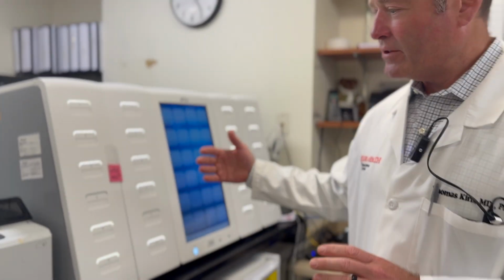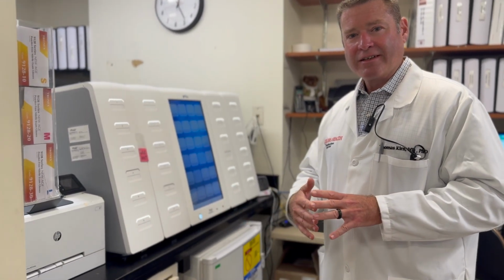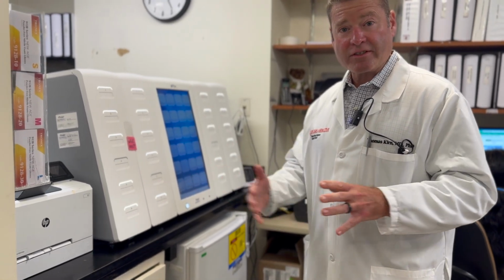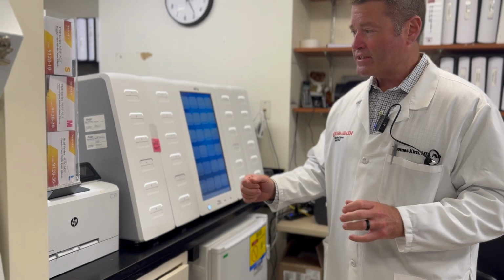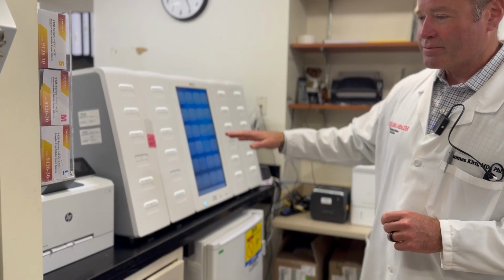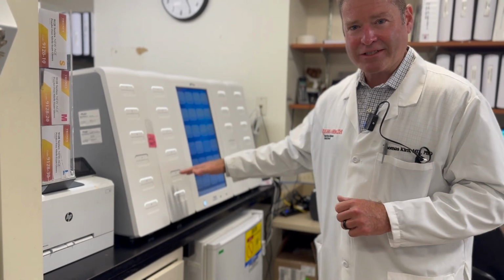So for example, we can do respiratory viral panel testing to detect 7 or 8 different kinds of viruses all at the same time. This could also be used for detecting many, many different organisms in the bloodstream, for example, or in a blood culture bottle, amongst other uses. So this is massively parallel molecular testing for infectious diseases. Well, that concludes the tour of the virology laboratory. Come on out here and we'll finish up.